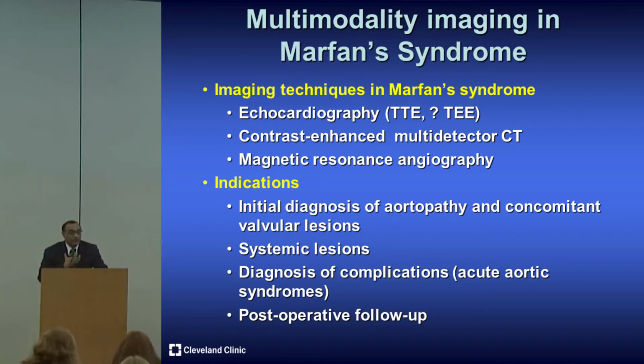Echocardiography, the sonography of the heart, where a sonographer puts a probe on the chest, or if you are unlucky, your doctor orders a transesophageal echocardiogram where there's a tube passed into your food pipe to take some pictures. Many of you may have had a CAT scan or an MRI of your aorta.